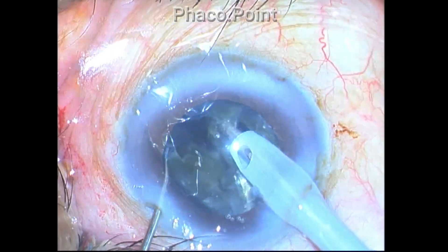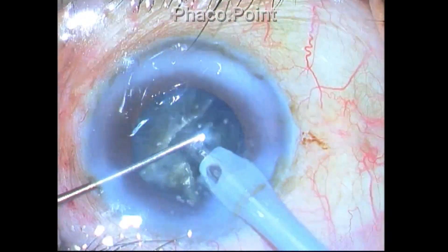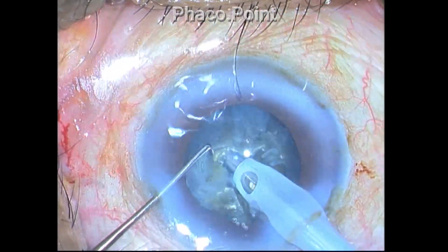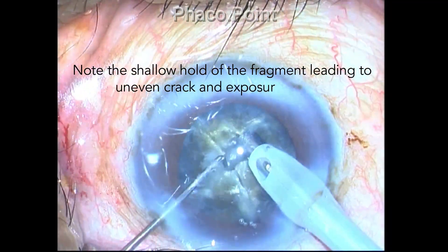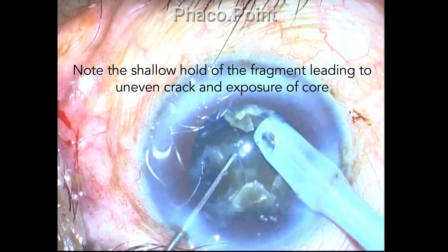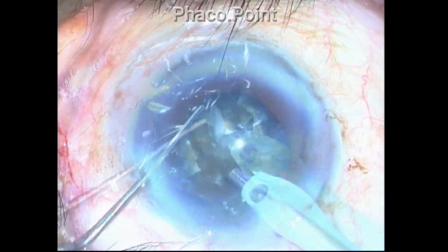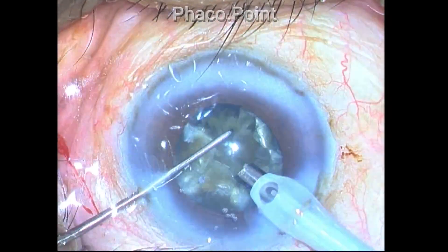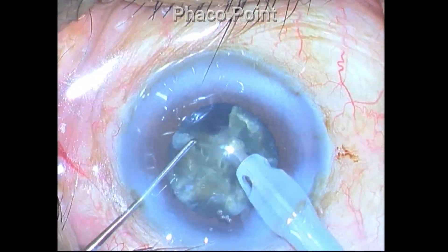Getting a good hold alone is not sufficient for success in a direct phaco chop. The hold is important, but you also need to effect a good separation. To achieve good separation, go into the depth of the nucleus and crack it within the fragment. If the hold is too shallow, you will get uneven size fragments.